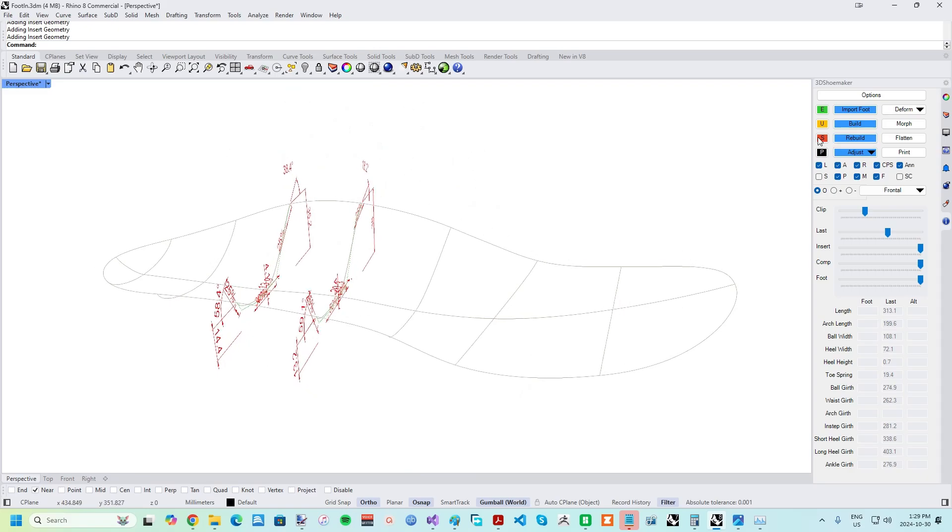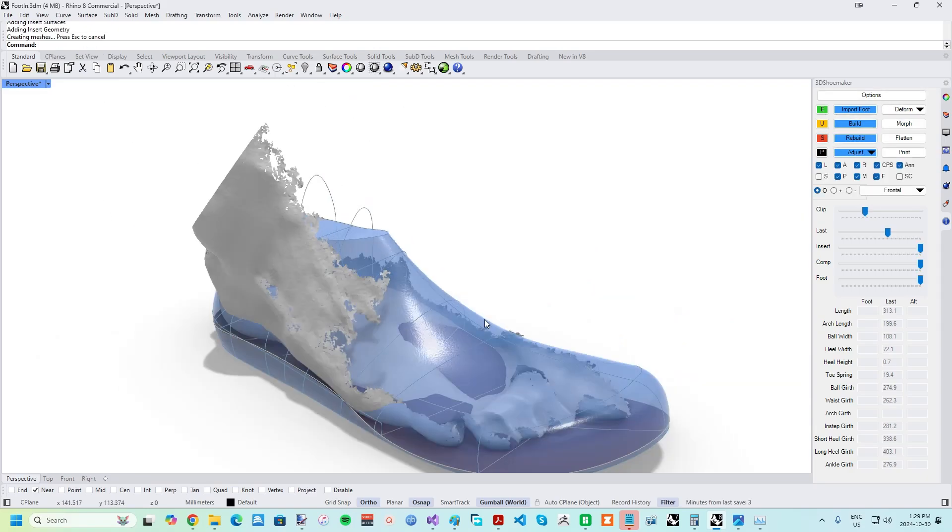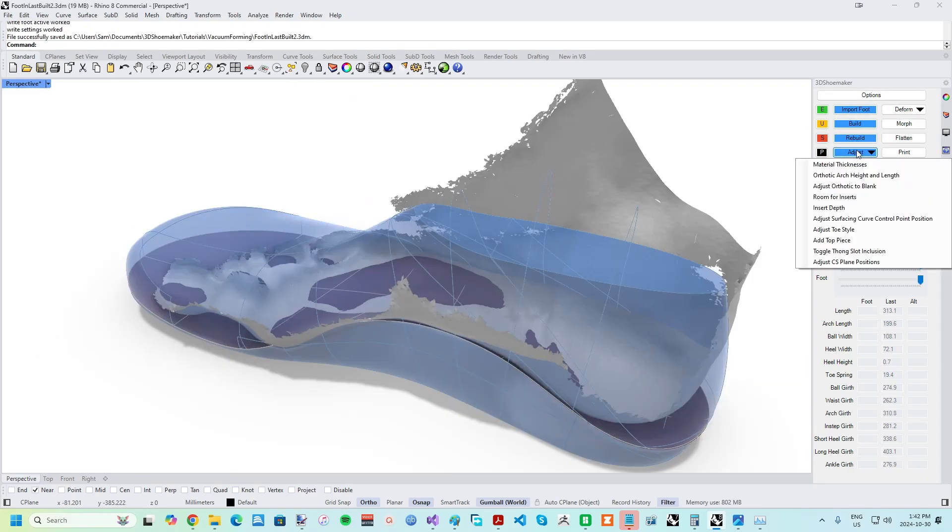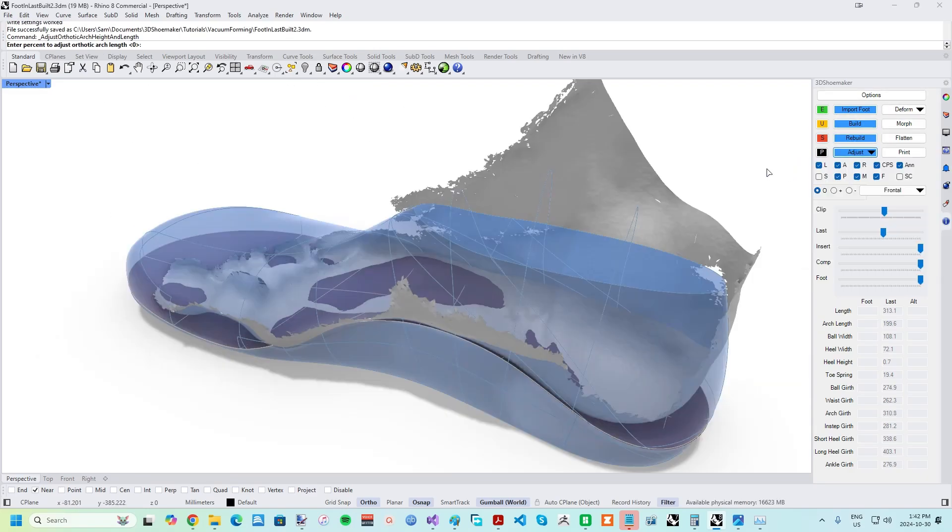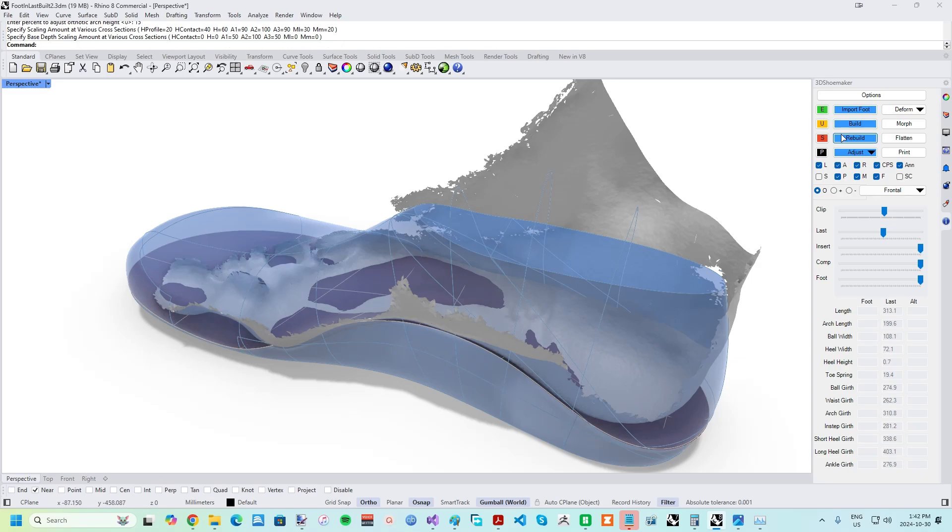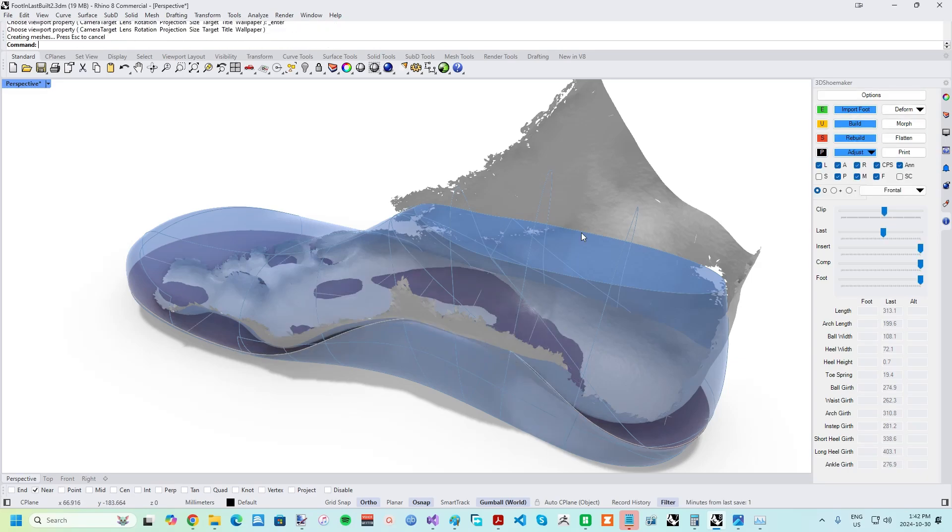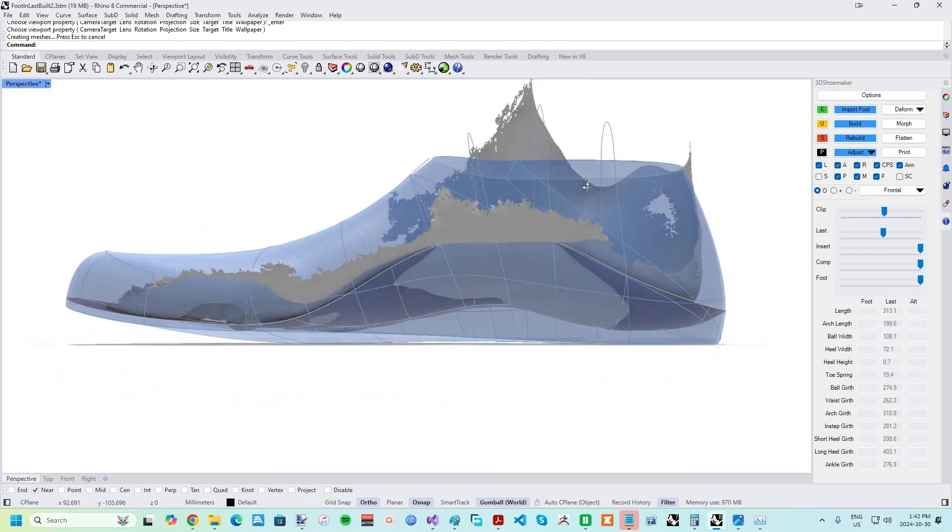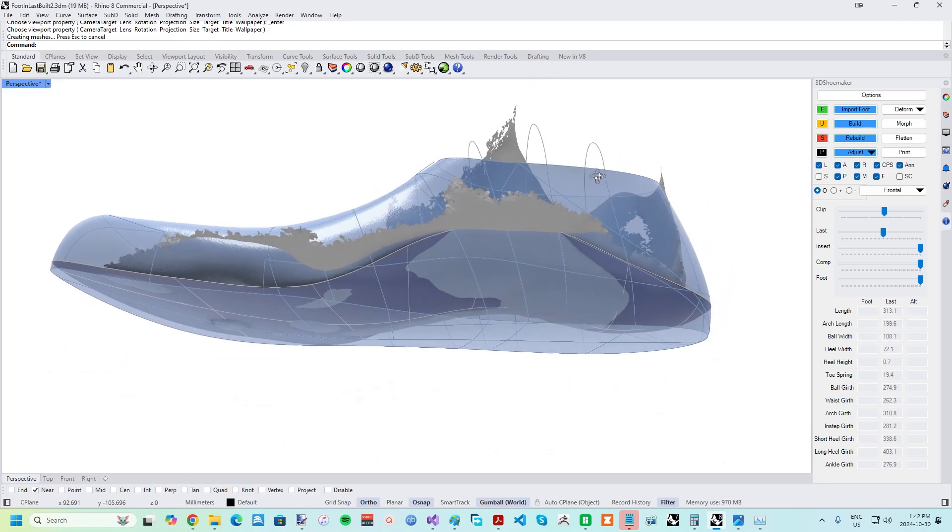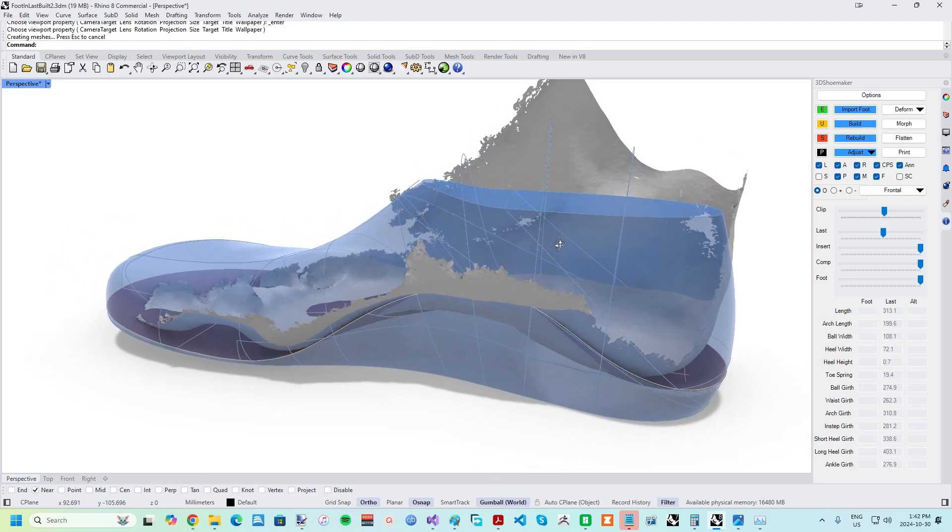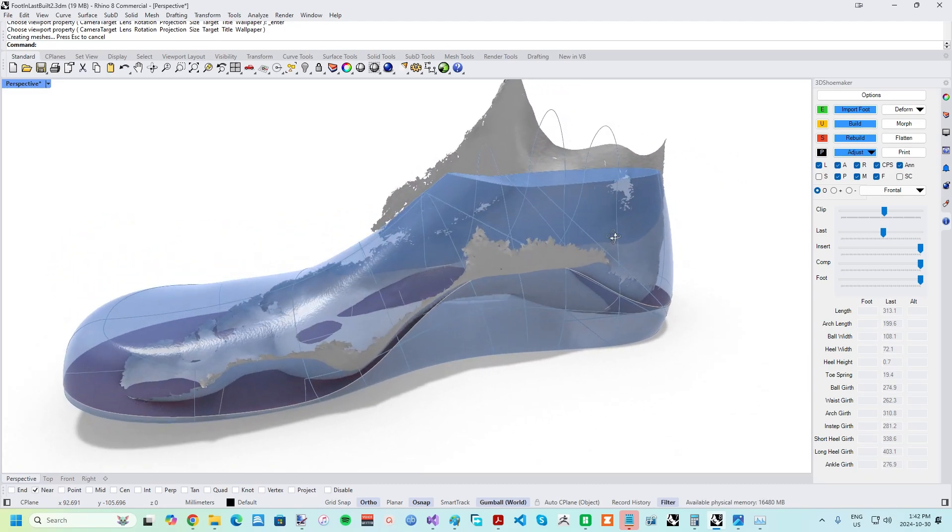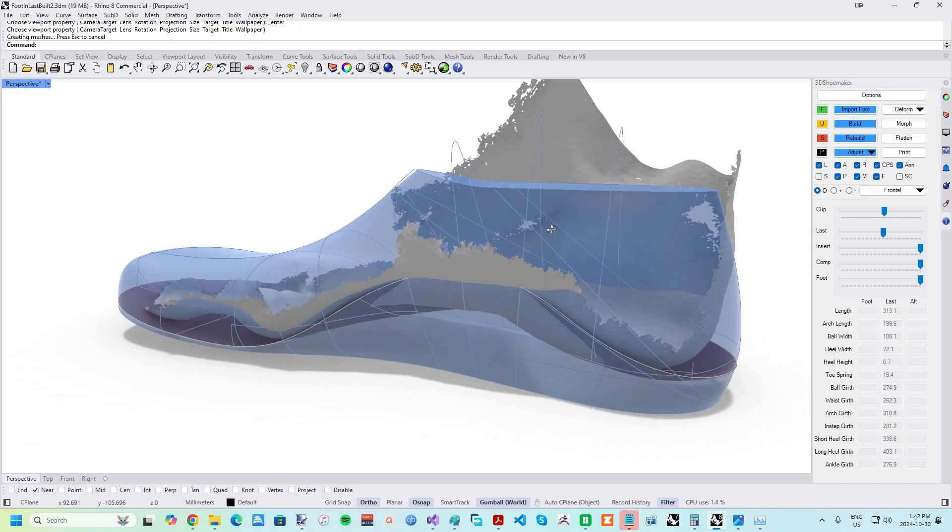Similarly, you could also refine an orthotic template and re-save it. For this foot, which happens to be mine, I'm going to reduce the arch length by 15%, given the very long first toe is taking up most of the shoe length, and I'll increase the arch height by 10%. These adjustments are done via the Adjust Orthotic, Arch Height, and Length function found in the Adjust drop-down. There are numerous other adjustments that could be done at this point, such as the Insert Depth via the Adjust drop-down, as well as more advanced things like hind and forefoot twists. I'll cover these in another tutorial.